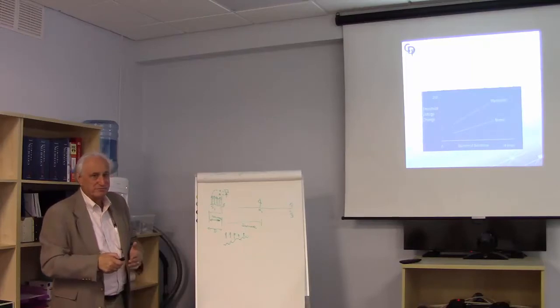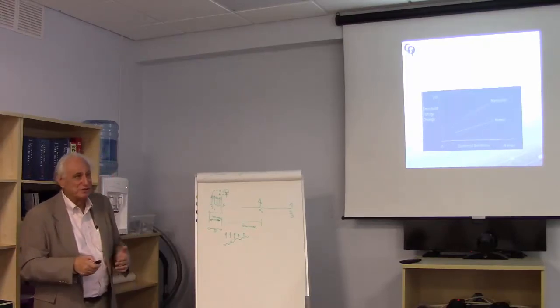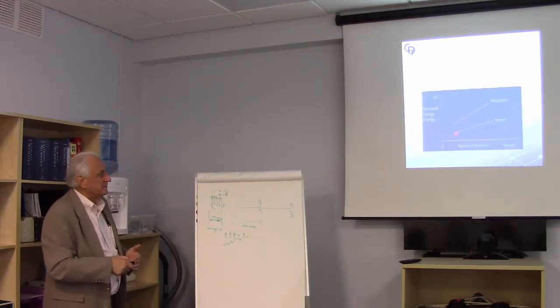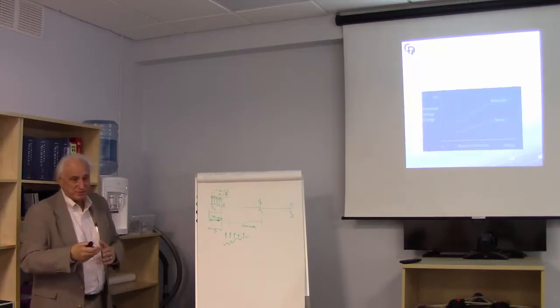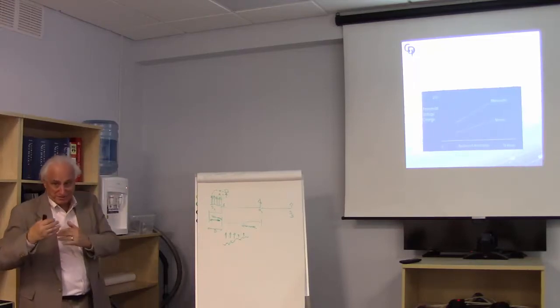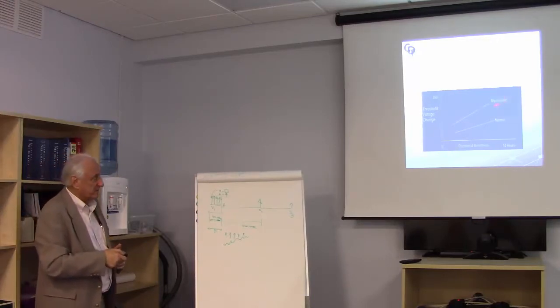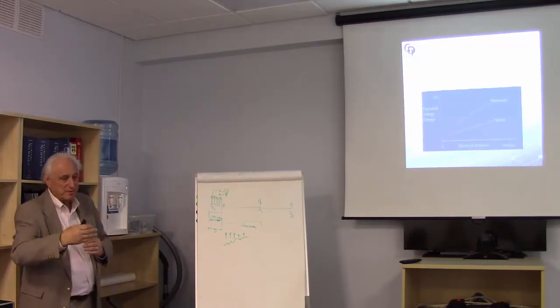Luckily, people aren't doing the 30-hour operations anymore. They're staging those now. But you can see what happens. In a normal subject, as time goes by, you actually have to adjust the stimulus intensity to maintain the same response size. In a patient who's myelopathic, you have to do the same thing, but you have to increase it by more.